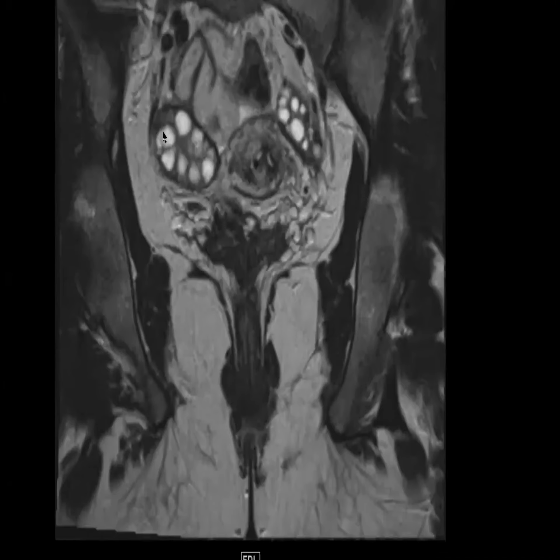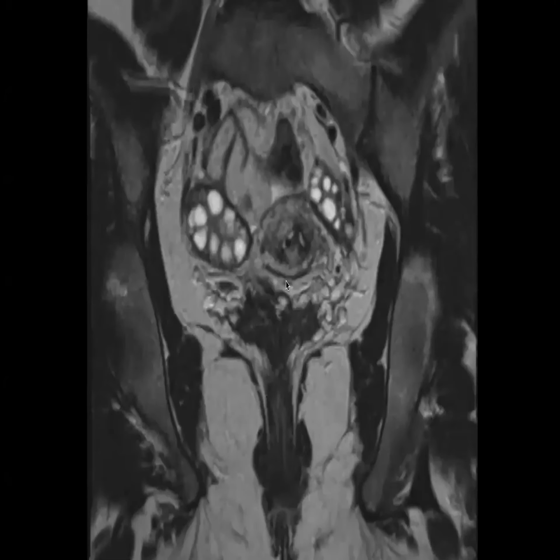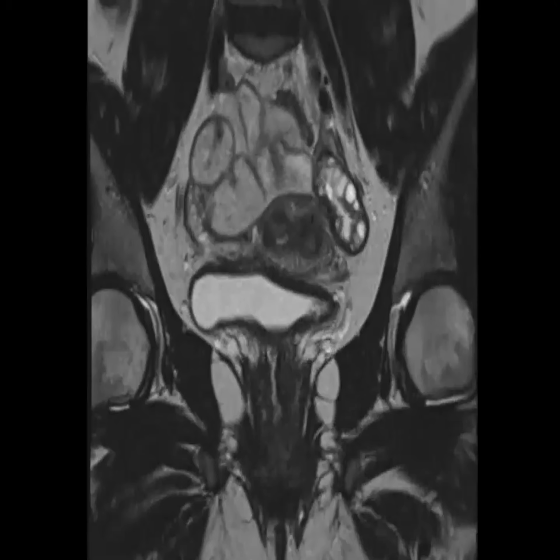Very cool, very complicated. Anyone else have any cases? I have one more acute one I can show if I don't crash. Let's see. Okay. So type into the chat or speak up. Let me know what you guys think about this one.